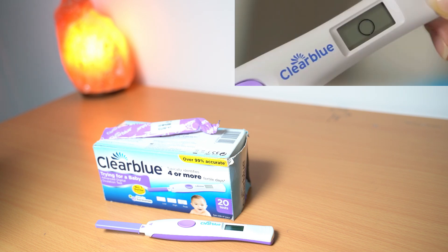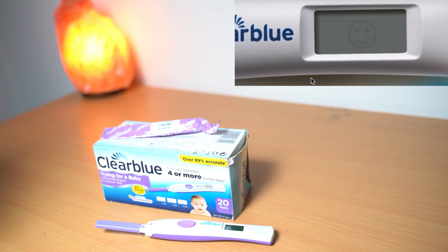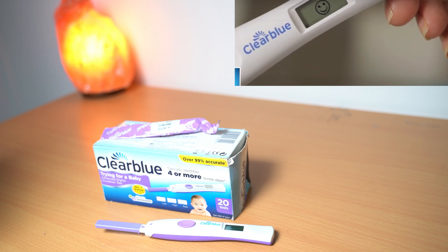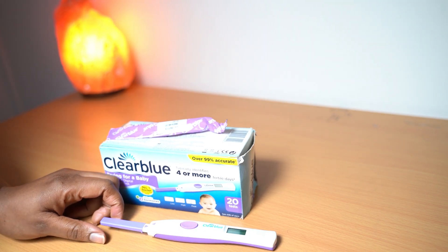The blinking smiley face tells you that it has detected estrogen, and the steady smiley face tells you it has detected luteinizing hormone. Those are the three results you're expected to have. This ovulation test I've had since I had Naomi and it's still working, so all you need to do is get more strips.